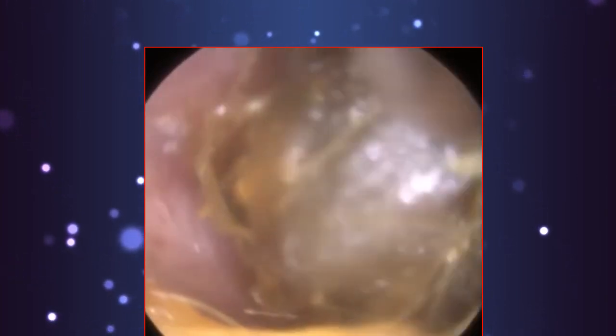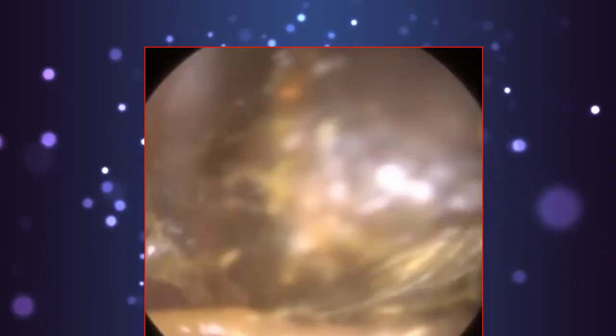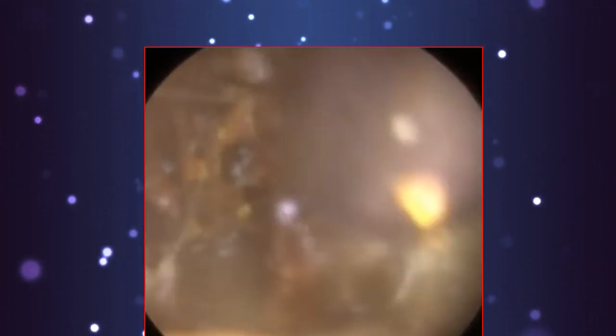Over the years, this wax impaction has been there for many, many years. The patient had been using cotton buds, so they've actually impacted a lot of these hairs deep into the earwax, so it's become matted, and matted earwax is very, very hard to remove because it's very hard to get a suction grip. So that's challenge one.